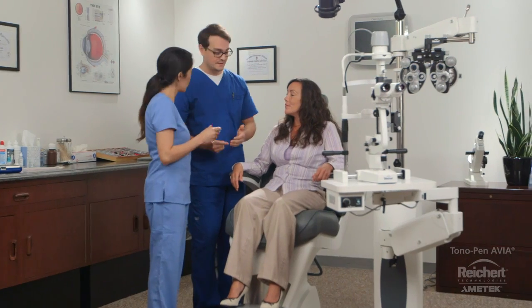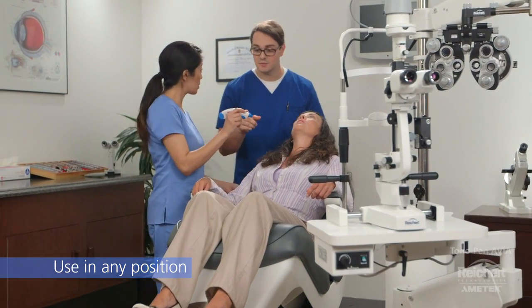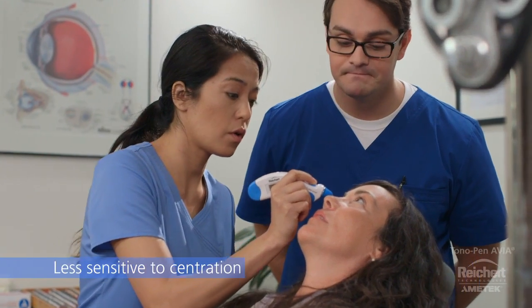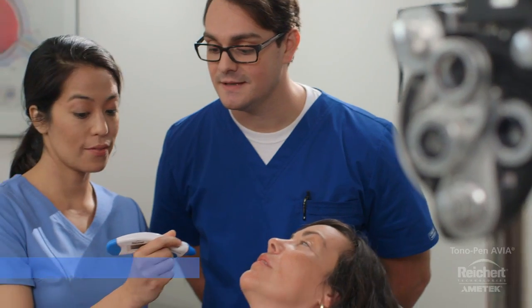Now it's Amy's turn. Tonopan Avia is gravity independent and can be used on patients in any position. Its microstrain gauge technology is less sensitive to corneal centration than other tonometers and provides fast, accurate, and repeatable results with minimal operator bias.